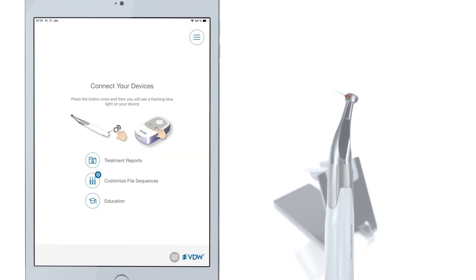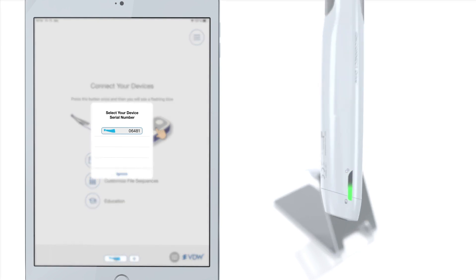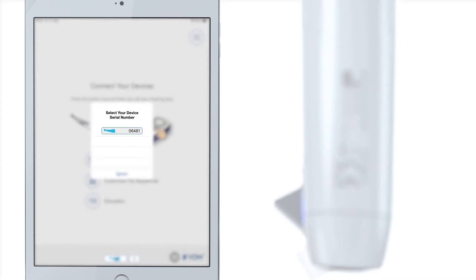Then, turn on the VDW Connect Drive by clicking on the button at the back of it. By clicking one more time on this button, you activate Bluetooth. Once opened, a serial number will appear on the Connect app screen. Double-check this number with the one you find on the VDW Connect Drive to make sure you have the right one connected.